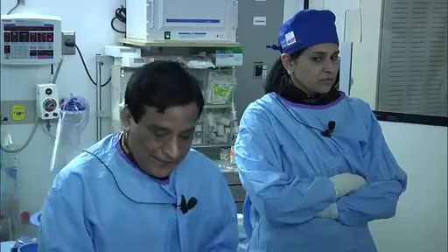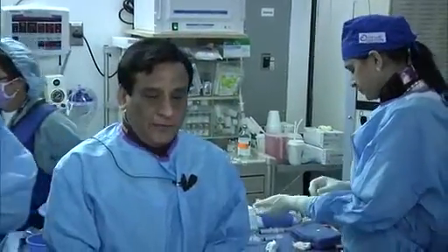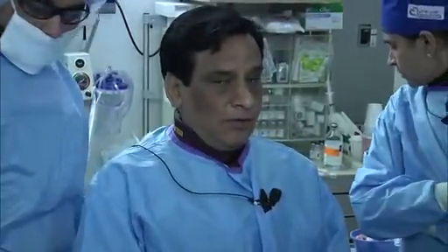Samin, you are also, I understand, going to be addressing the very important issue of staging of PCI today. Yes, with the recent papers in JACC, two of them with editorial, it has come to the limelight. We always try to bring our audience and every interventionalist the latest advances, so we can change our practice, and that will be the goal today. So with that note, let me quickly start because we are ready for the case. We are a little delayed, but we should still be able to finish around 9 a.m., maybe 5 minutes extra.